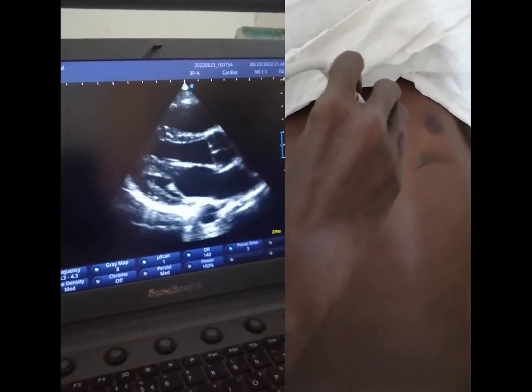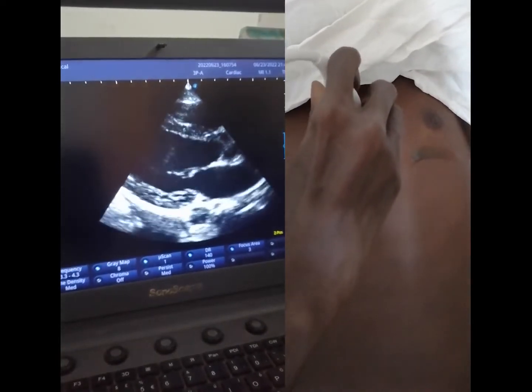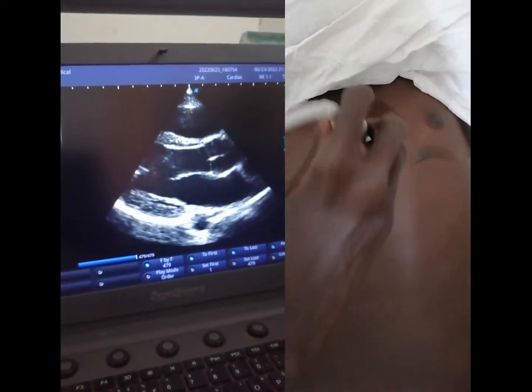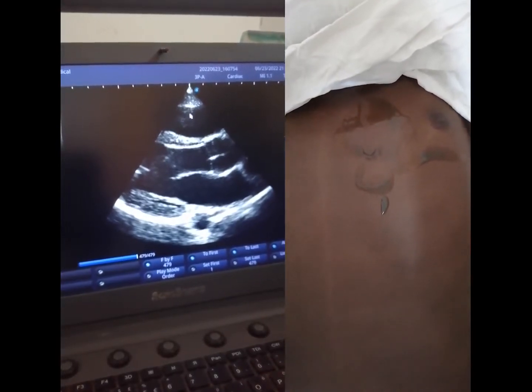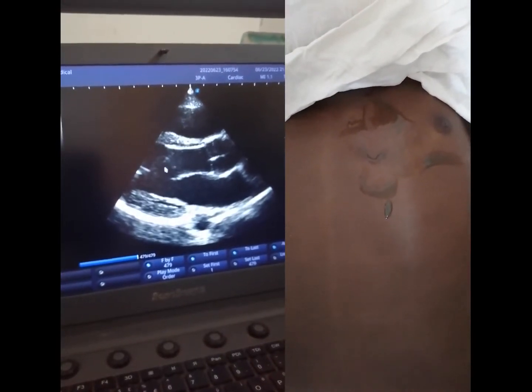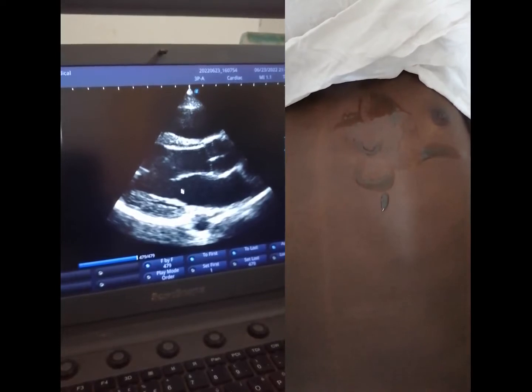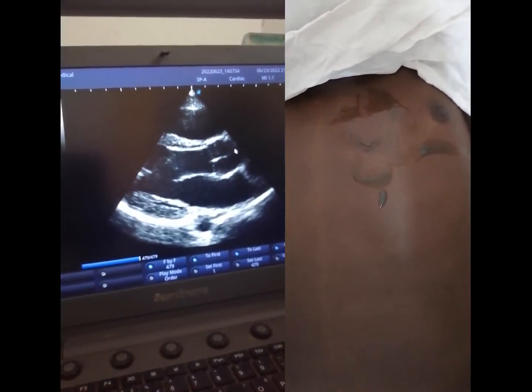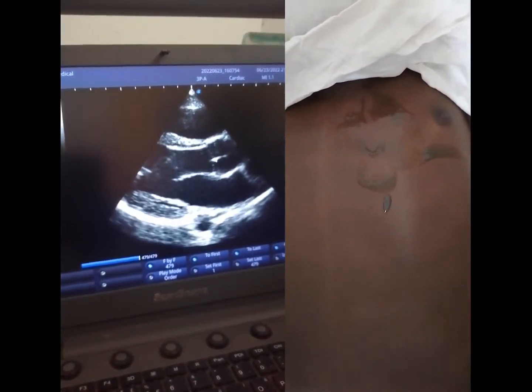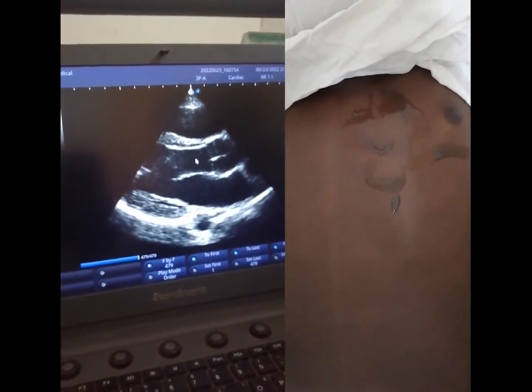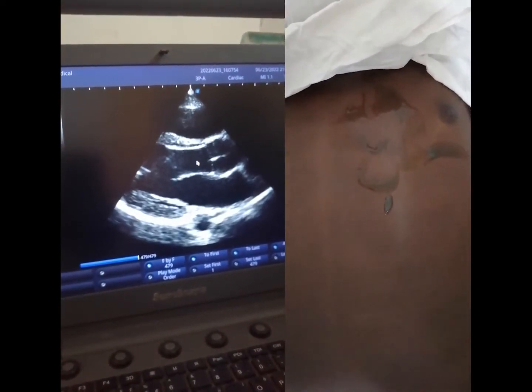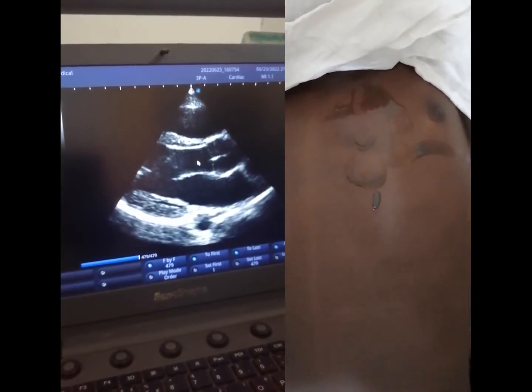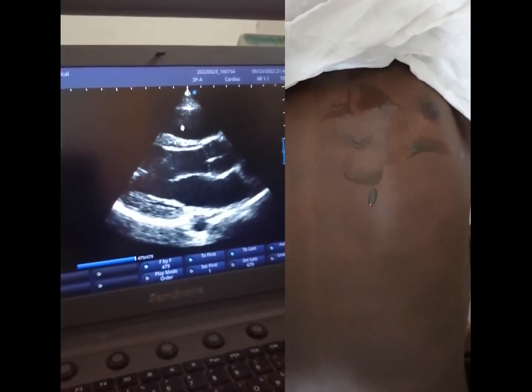This is the best view of the parasternal long axis. Here we have the right ventricle, here we have the left ventricle, and there is the mitral valve anterior leaflet, here is the aortic valve, and here is the LVOT. This is the parasternal long axis view.